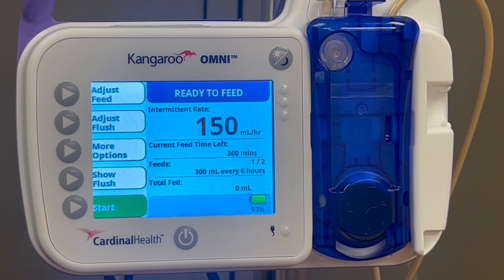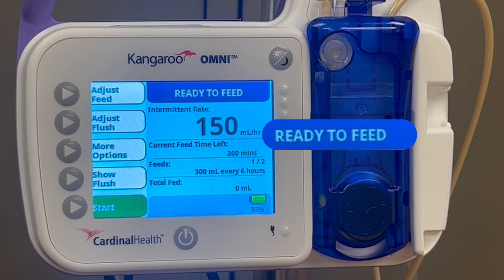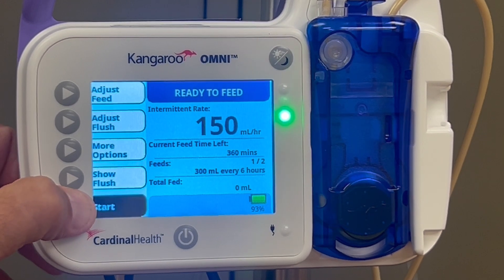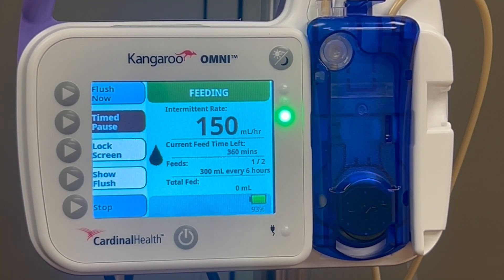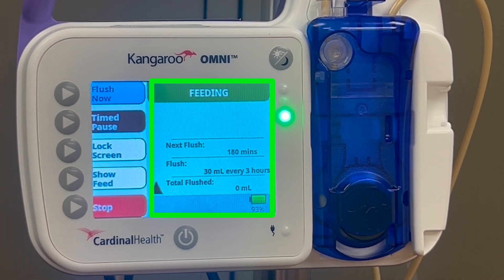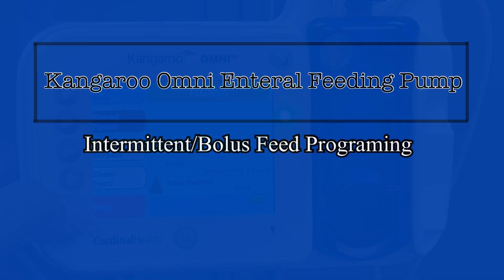On the main screen, you should see Ready to Feed and have the option to start the feeding schedule. Press Start. Your bolus schedule is now running. You can also see all your feed information on the screen, and by pushing Show Flush you can see your flush information. Your pump is now programmed to deliver a timed bolus of nutrition to your patient. Great work.